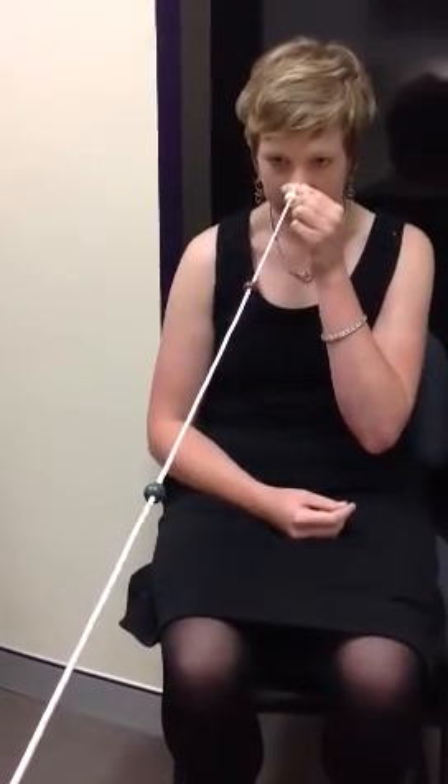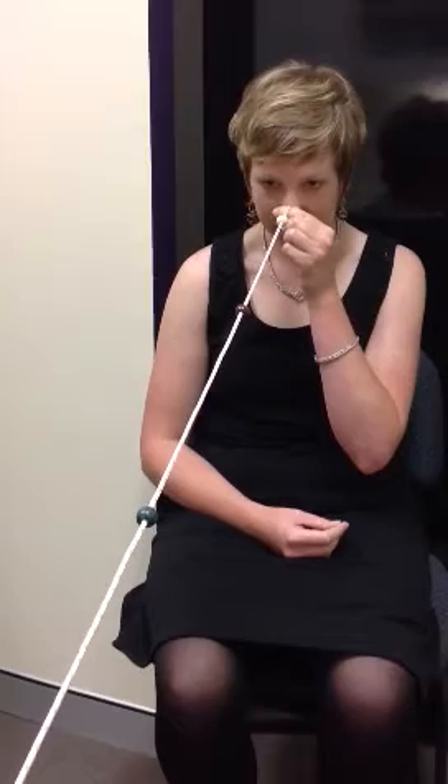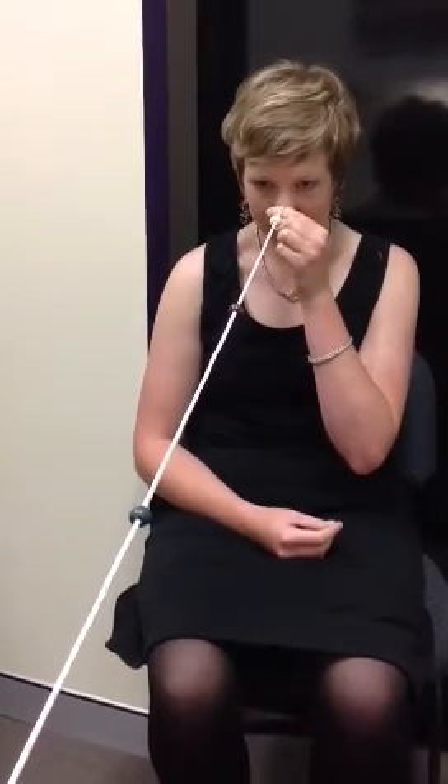Now look down the string and look at the green bead. How many strings do you see leading up to the bead? Two. Did the string cross at the bead? Yeah. Okay, look at the brown bead closer to you. Can you make the string cross at the bead? Yes.